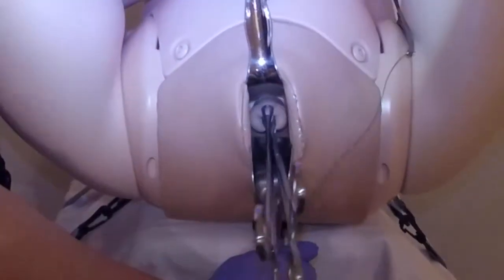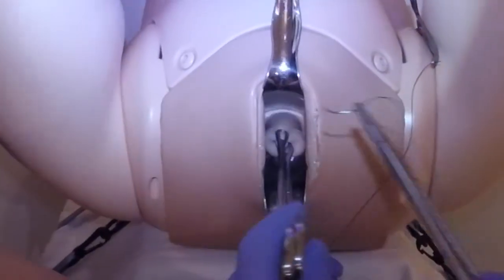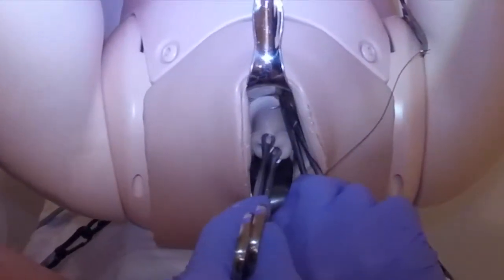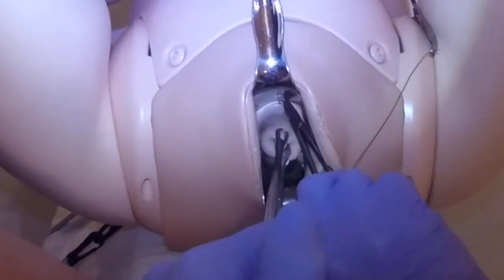My needle is slightly biased upward so I can get even higher. Daisy, if you continue at six o'clock and twelve o'clock — that's lovely. I'm going to take my first bite as high as I can, and then possibly even higher.